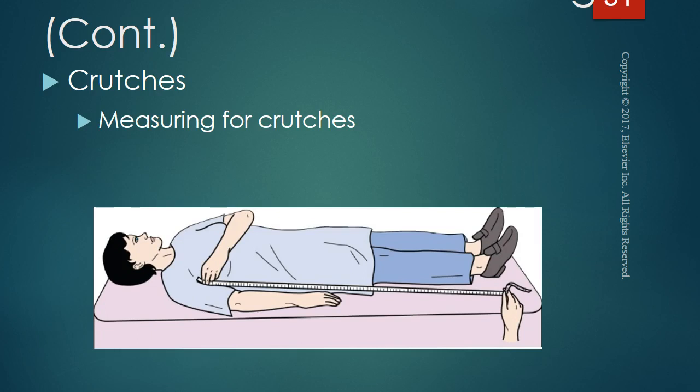Position the hand grips so that the axilla is not supporting the patient's body weight. Pressure on the axilla increases risk to underlying nerves, which sometimes can cause partial paralysis of the arm. So therefore, you want to avoid the patient hanging on the crutches.